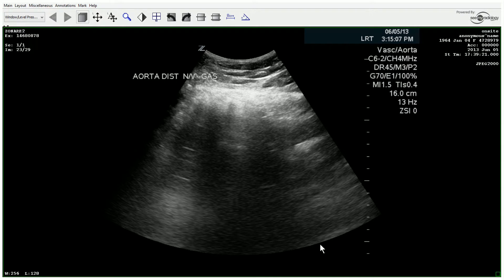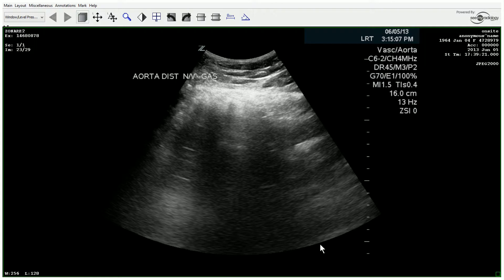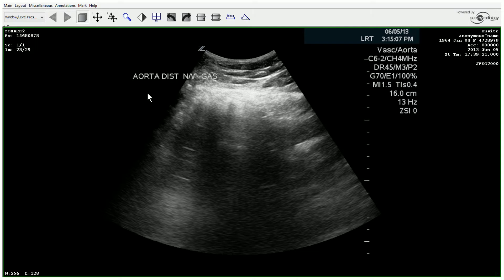We don't see any areas of focal stenosis. So the next thing to do is go upstream and check out the aorta — to see if there's an obstruction, maybe an abdominal aortic aneurysm, or perhaps an aneurysm in one of the common iliacs. You'll want to investigate further.